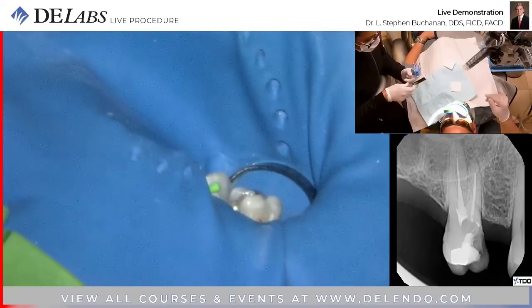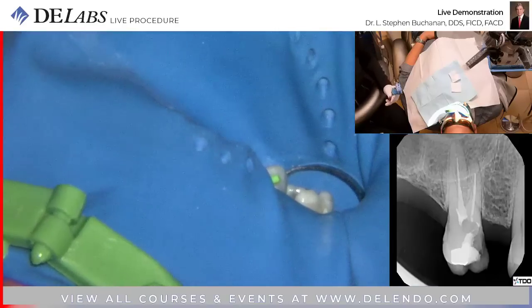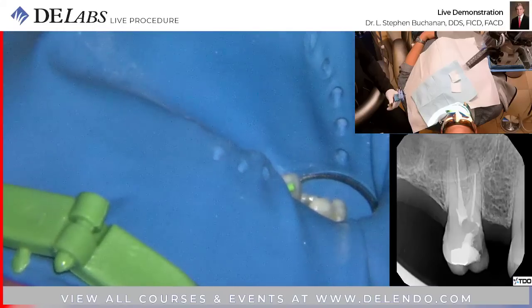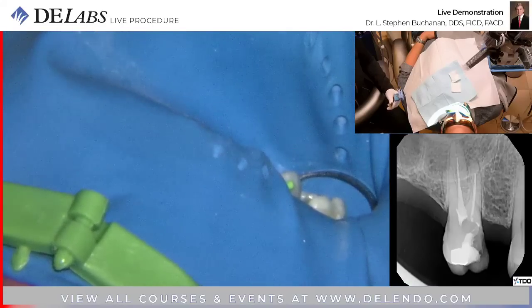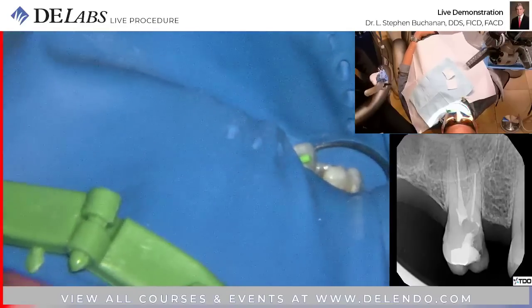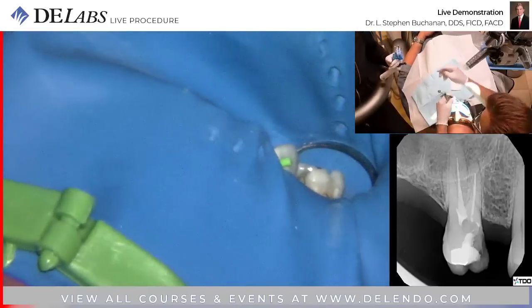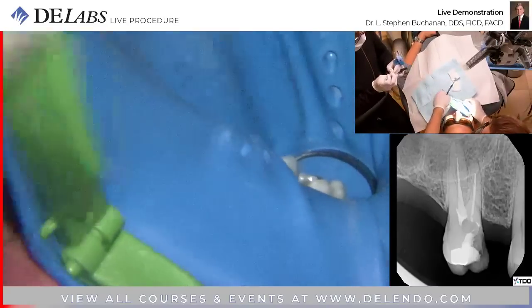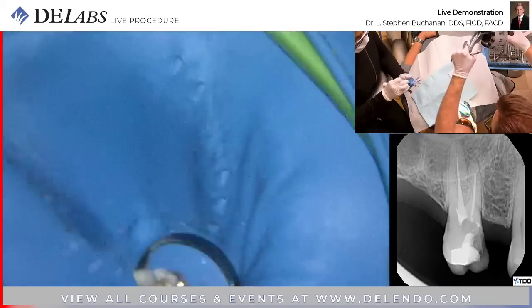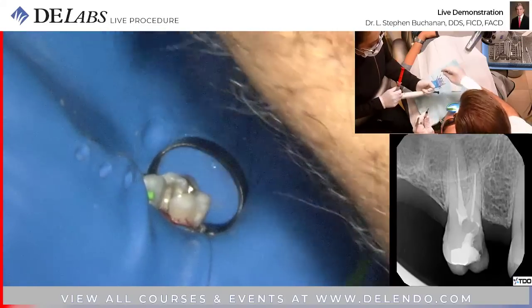Those little nubs are for every tooth position, upper and lower. You just pick the one that's related to the first molar, clip it, and then that's a hole. It's a projected sheet material. It's not solid. It's hollow in there. You clip it, and that's your hole. But you have this little stand-up turtleneck on top of it. It's great. Okay, and then this hinged rubber dam frame, not from the same company, but it's fantastic. We haven't had to take many working films, but what am I doing here?